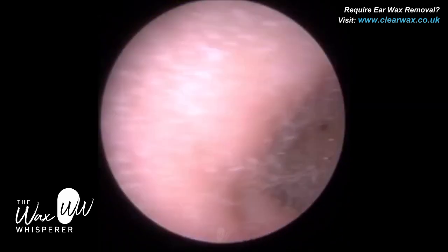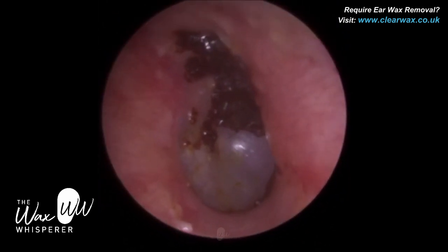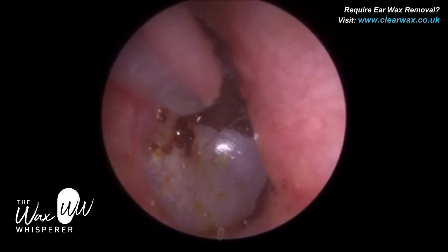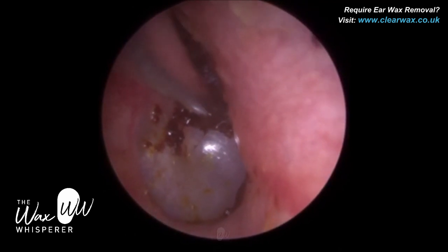Superior means the top part of the eardrum — the roof. Anterior means to the right, so the front. It's that little quadrant — it's like if we were to slice a cake, you can see there's a little quarter section of wax right on the eardrum.